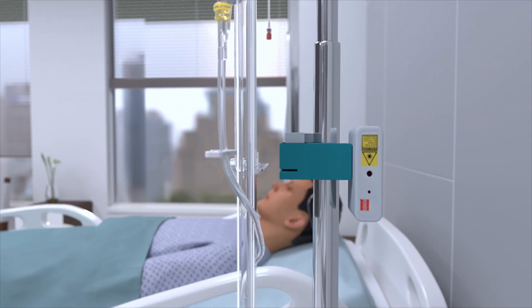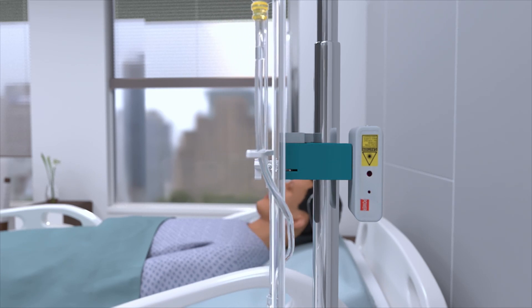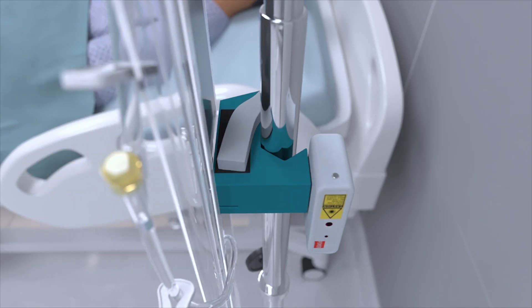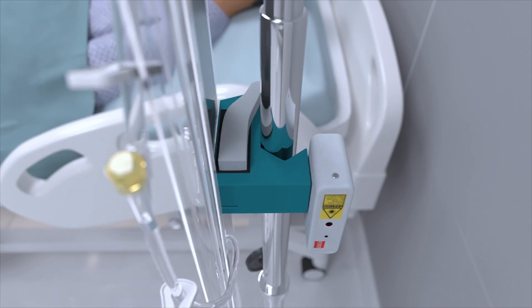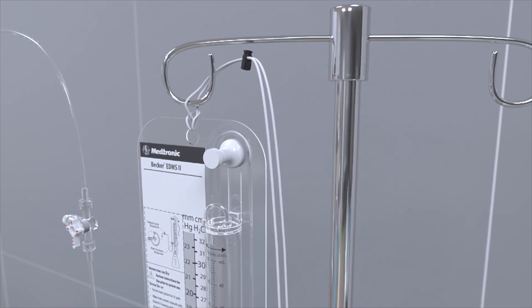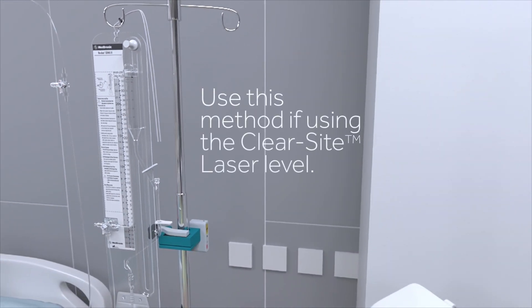Slide the Becker into the slot on the IV pole clamp. Alternatively, the Becker may be hung on an IV pole using the cord with cord lock. Use this method when using the ClearSight laser level.